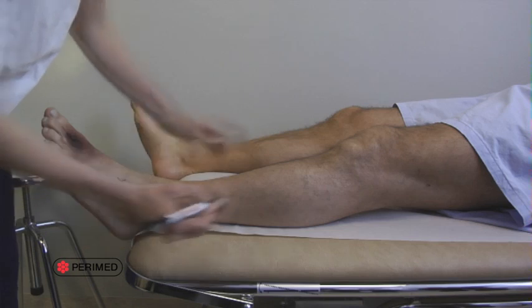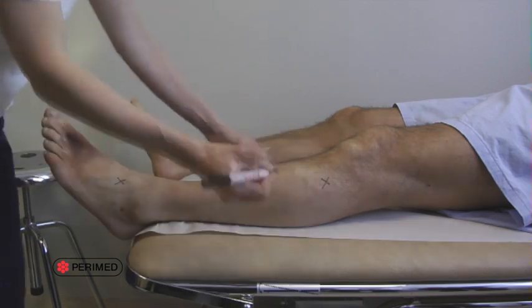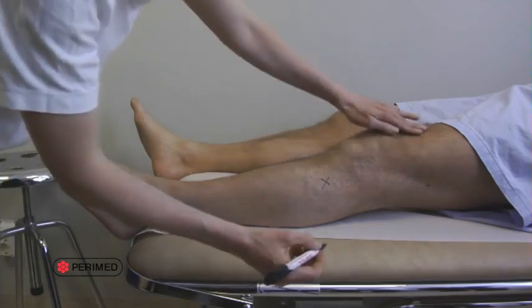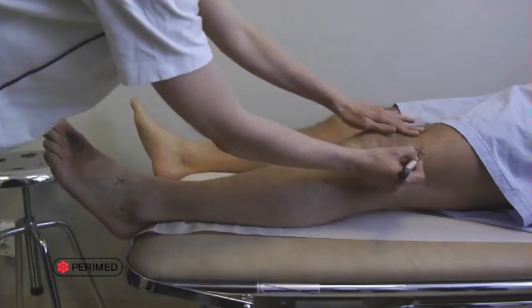The next topic is predicting amputation healing. Unfortunately, many patients with leg ulcers require amputation. The goal is for the amputation to be performed at the most distal level possible in order to maintain the best possible function. However, the more distal the amputation, the more likely the surgery is to fail. So tcpO2 can be used to find the optimal level of amputation, hopefully preventing failed surgeries.